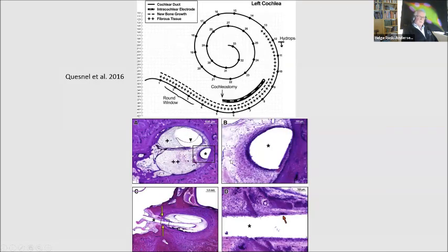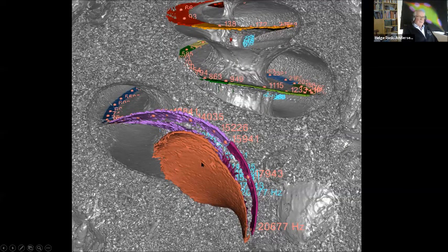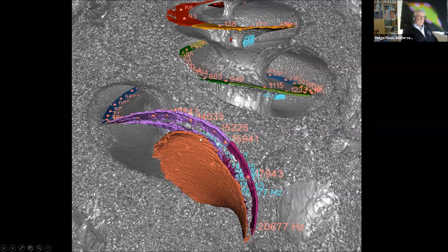And doing a cochleostomy, well, we have this paper from Boston showing what happens when you do cochleostomies, and there is an inflammatory reaction, usually more or less heavy inside the cochlea, which maybe is not good in the long run. So I think we should all try to do this surgery atraumatically. And I guess the best way would be the round window insertion, just to show how nature has solved this anatomy, to have a functioning high-frequency basilar membrane around the human round window.